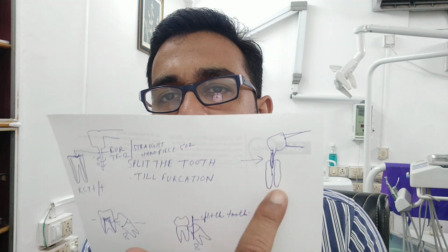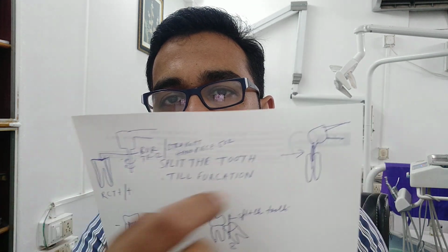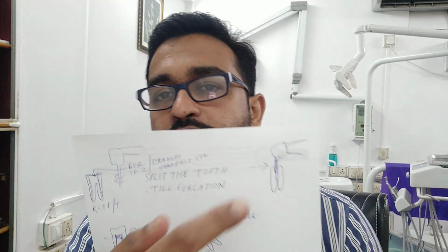Then you can cut the roots from the furcation level. मतलब यहाँ से आप will cut it from here. Can you see this? After cutting this, you apply the Coupland in between that and slightly try to luxate. It has to be used in anti-clockwise motion always. Coupland का rule ये होता है anti-clockwise. So once you do it, what happens? Though you see the tooth has started moving.